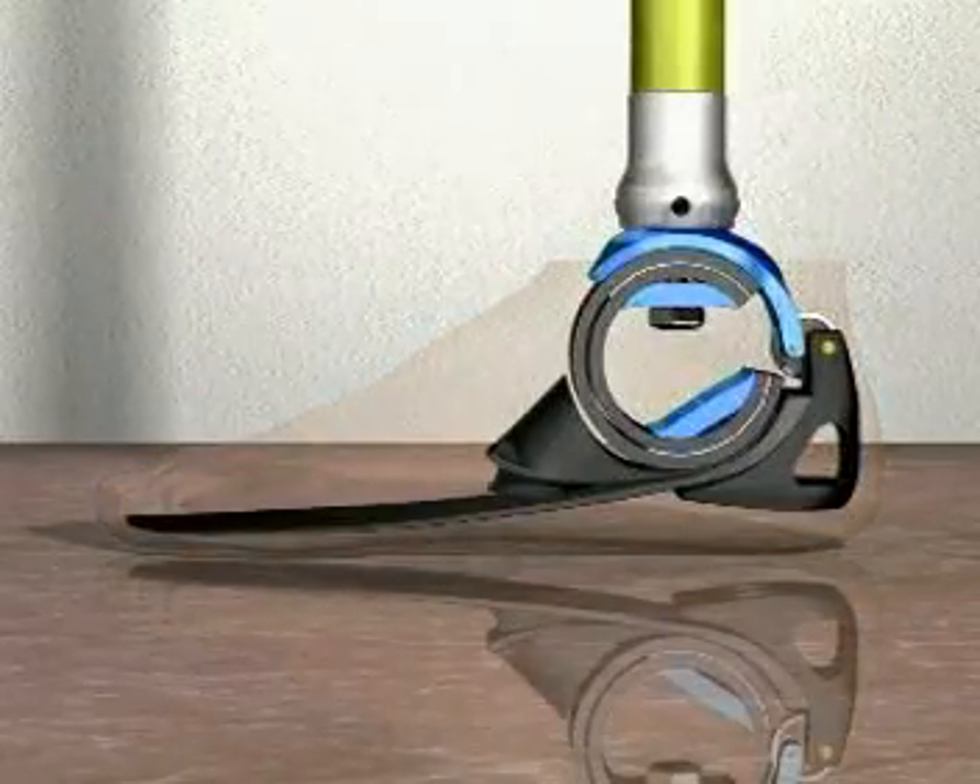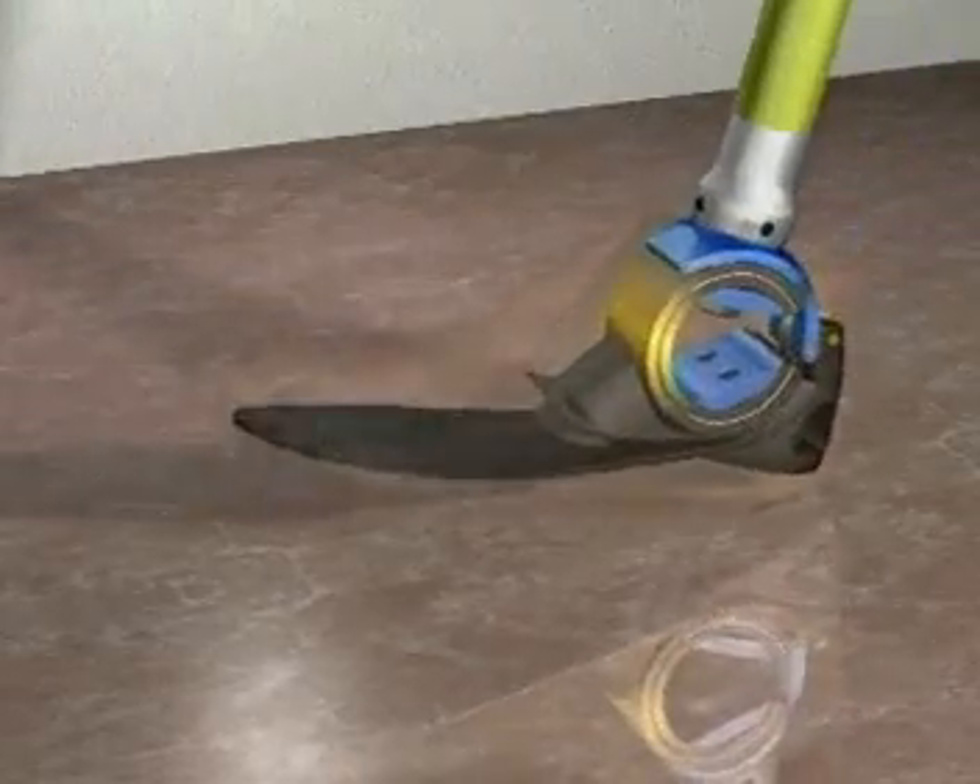This prosthetic foot is specially designed for optimal energy storage and return, which flows smoothly from one element to another.